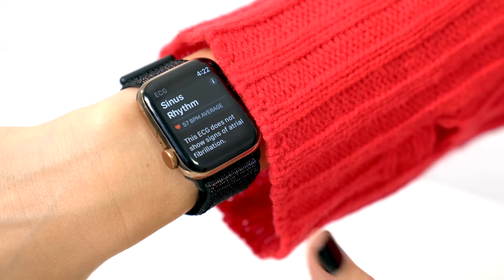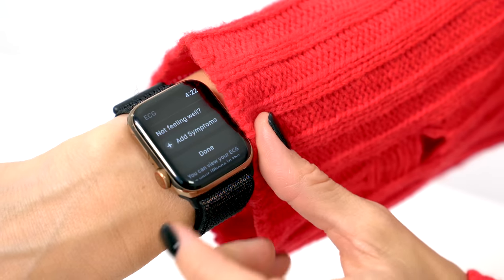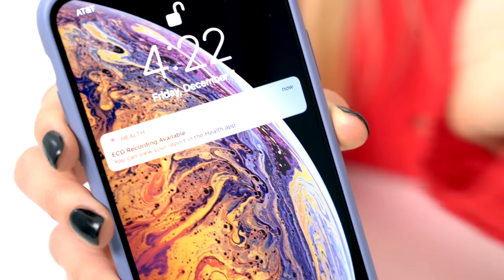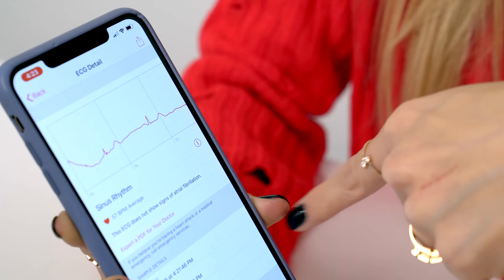And there is my reading right here, and this automatically gets sent to my iPhone. You can add symptoms or just click done. And then over here on my phone, you can see that the ECG recording is available. When we open that up, I can get the reading of what my ECG was, and I can export this as a PDF to my doctor. I don't have a doctor — I should probably get one so that I can send them my PDFs.